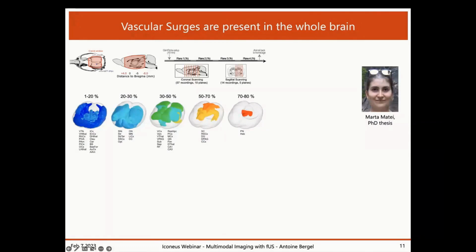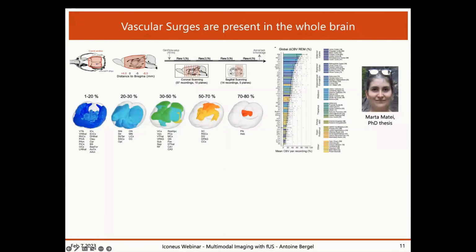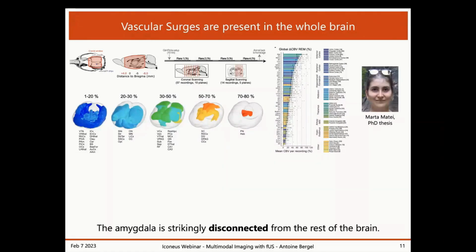And you see exactly the same pattern. You see that most of the time, the activity is moderate at the periphery, but it's super strong at the center part and in the other cortex regions of the brain, here also in the thalamus and the midbrain. And you have a super clear view here, and you see how powerful fUS can be, because it gives you information and you're able to scan a very large number of regions. So we were super happy about this result.